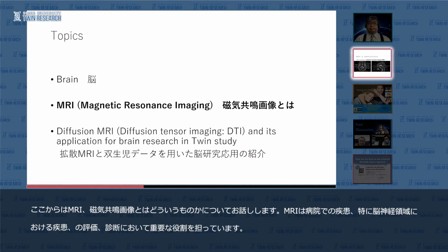Okay, in this section, I'll talk about MRI, magnetic resonance imaging. An MRI helps a doctor diagnose a disease or injury, and it can monitor how well we are doing with a treatment. An MRI exam can be done on different parts of your body. It's especially useful for looking at soft tissues and the central nervous system.